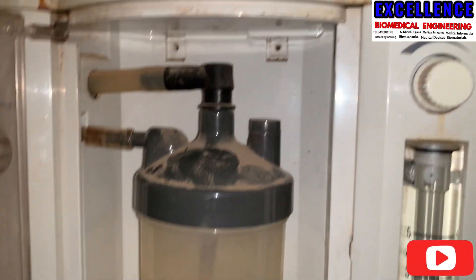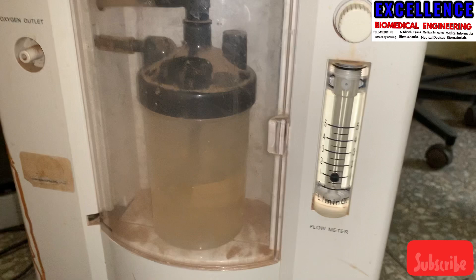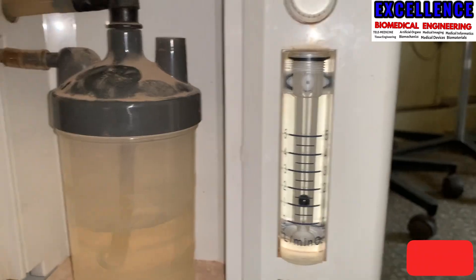Hello viewers. On today's video, as you can see, we have an oxygen concentrator where the flow meter is not functioning very well. As you can see, the ball inside the flow meter is not indicating that it's working.